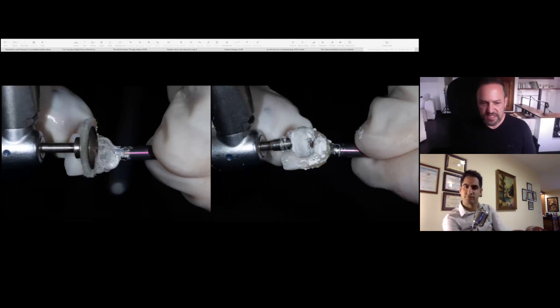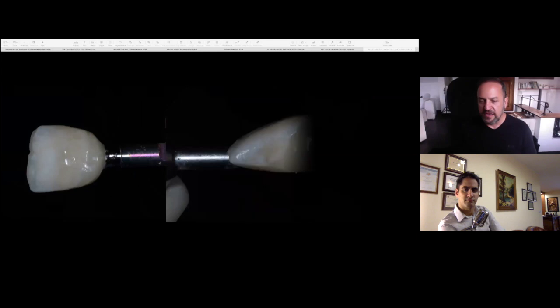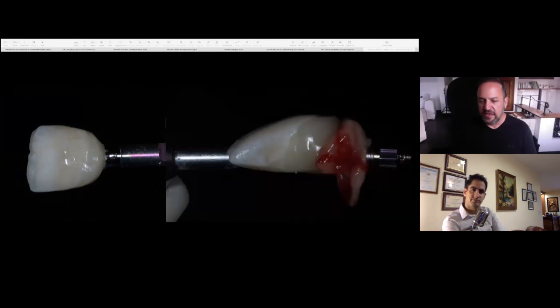So here you can see with the different pastes, just polishing everything up. And here you can see now with the final contour that we've achieved, we now have the final correct contour that's going to sit very, very passively. I add a little bit of PRF just to kind of seal the area there as well. Completely anecdotal. There's no scientific evidence to show that this does anything better. It's just a feel-good thing, and you can do it or not do it if you want to.